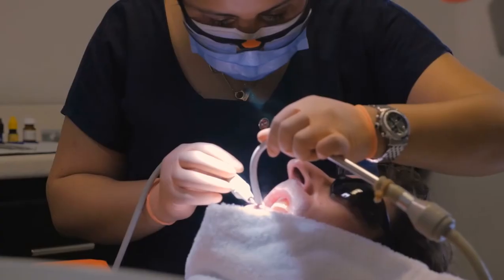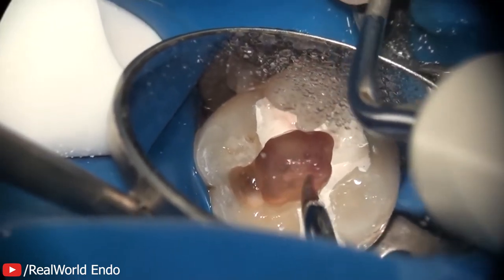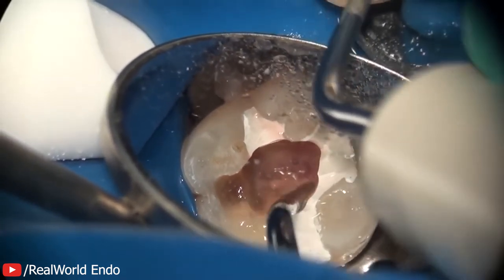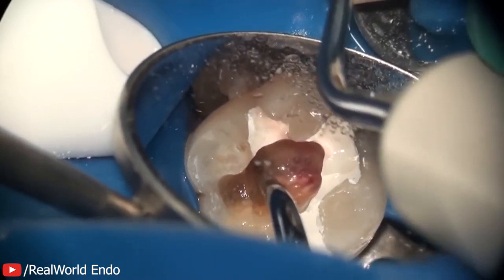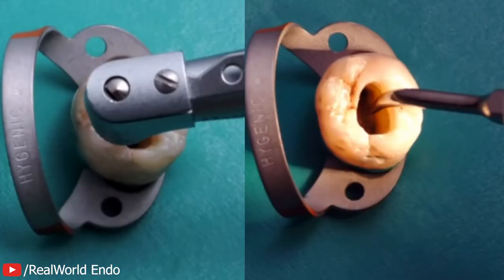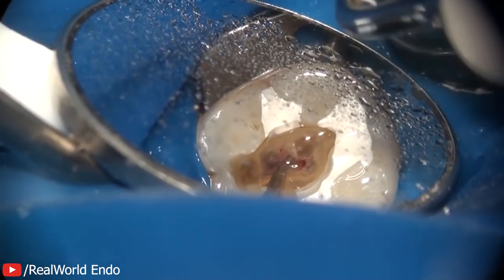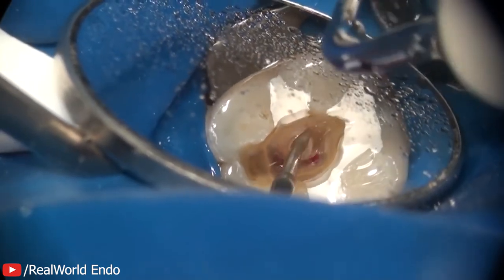So our fourth tip is to use an ultrasonic scaler to its full potential. We could make a whole video on the use of ultrasonics in endo because there are so many uses, but here are a few ways it can make your life easier. Think of your ultrasonic scaler as a safer slow handpiece with much better vision. You can use it to remove dentine when you're searching for canals — it's much better than the slow handpiece because you remove dentine in smaller increments with much more control, and you can see better since the tip is very thin whereas the slow handpiece blocks your vision completely. It's also the best way to remove pulp stones and pulp tissue when using a combination of sodium hypochlorite, and lastly you can use it to initially open up your canal orifice.